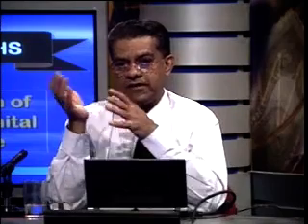So you should be able to first diagnose the Eisenmenger physiology, and then only you will be able to look at the ECG. Very rarely, patients with Eisenmenger physiology can have left ventricular hypertrophy. In all of them, it is usually a complex heart disease where the right ventricle has not developed at all. Tricuspid atresia, single ventricle, all these patients, since they don't have a right ventricle, will per force show left ventricular forces. But single ventricle, etc. are very rare diagnoses in clinical day-to-day practice.